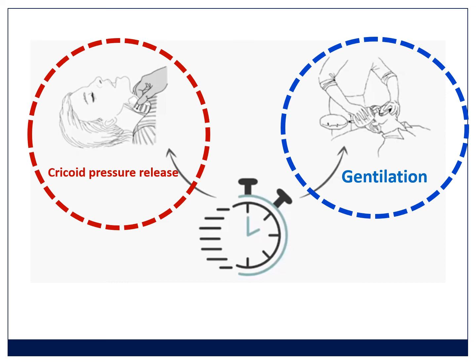The Difficult Airway Society guidelines recommend you do this gentilation, or at least consider it, in obese patients, in patients with reduced functional residual capacity, with a higher metabolic rate, or a potentially difficult airway. And if you think about the pregnant patient, quite often you're on 4 out of 4 and always on 3 out of 4. So this is a practice that I do in every single obstetric GA that I do, and I found it really makes a difference, and it's something that you should consider.